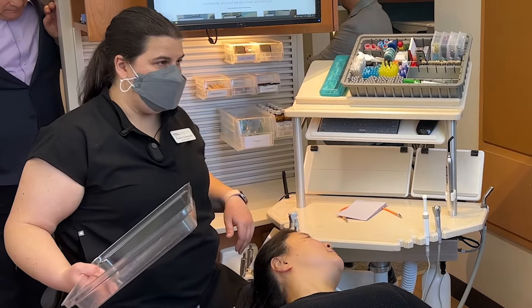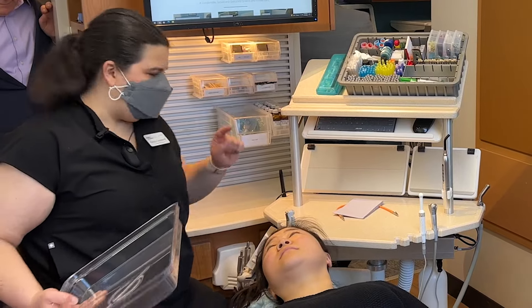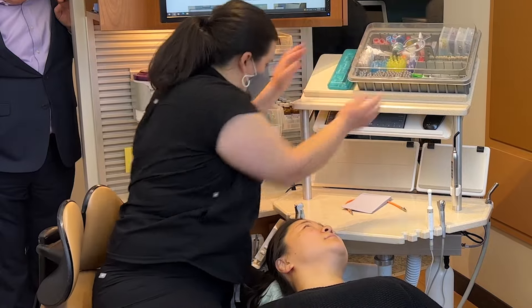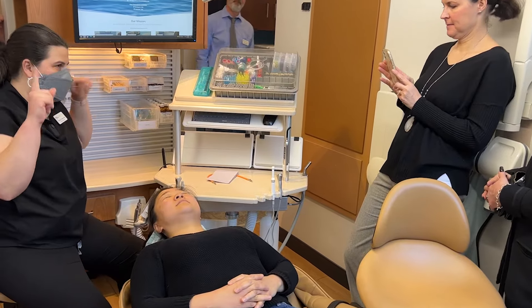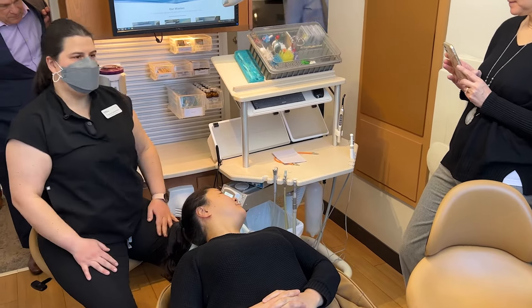It can actually be pushed back a little bit more. I tend to sit in this position. But if I was a hygienist that wanted the 12 o'clock or the one o'clock position, that's your position for one-handed or two-handed — one person in the room. When you're working with your dental assistant, your position alters and changes. You now want this at the fingertips of the user, so your dental assistant would take that chair position.